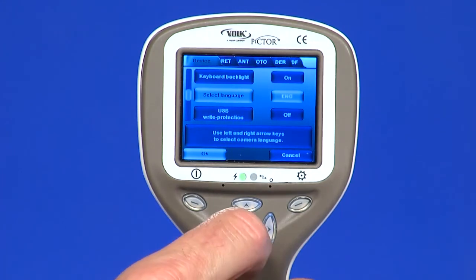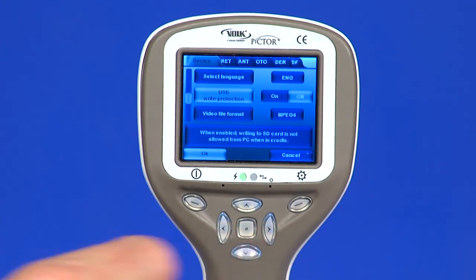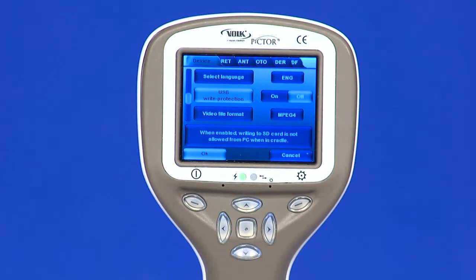USB write protection is recommended to be turned on by the user. When this protection is on, it will prevent any virus from entering the camera from a computer when connected to the cradle.